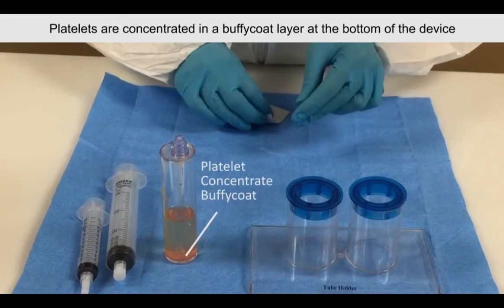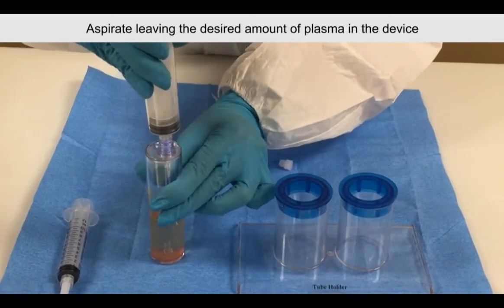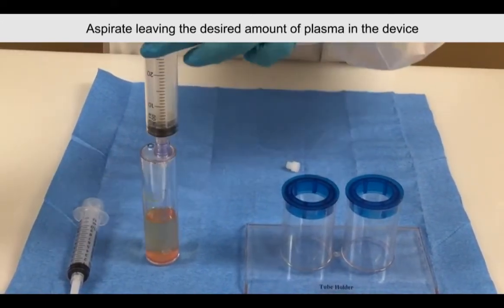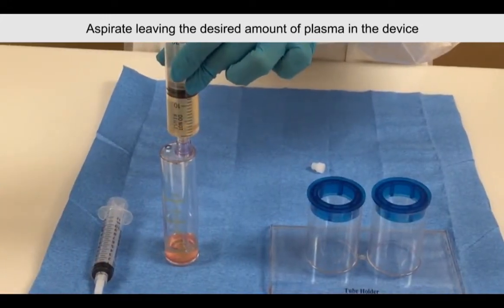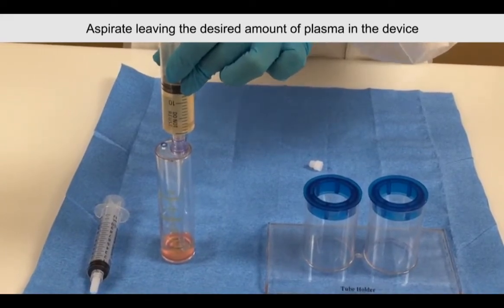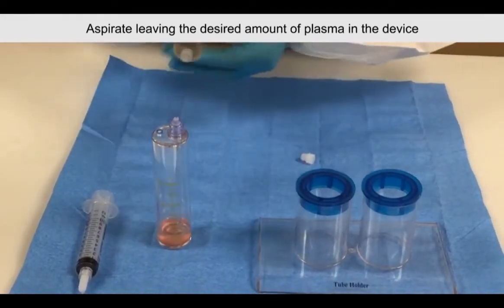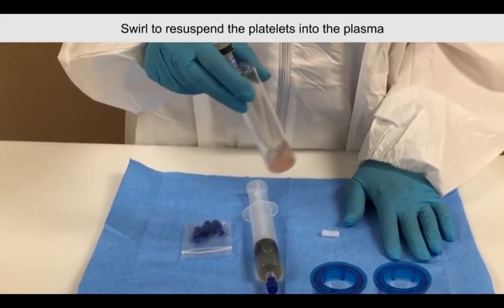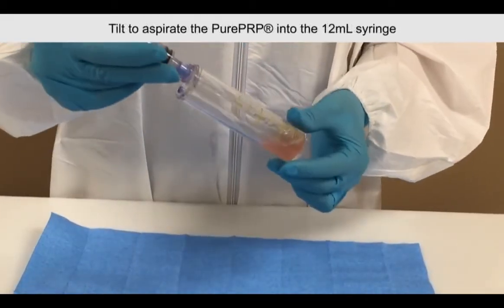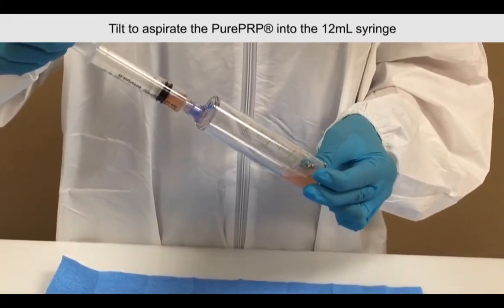When completed, the platelets will be concentrated in a buffy coat layer at the bottom of the concentrating device. Using the 30ml plasma syringe, aspirate the platelet-poor plasma, leaving the desired amount of plasma in the device. Attach the 12ml syringe and swirl the device to re-suspend the platelets into the plasma. Tilt the device to immerse the aspirating pipe into the pure PRP, then aspirate the pure PRP into the 12ml syringe.